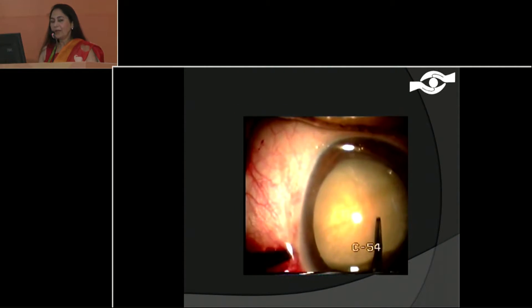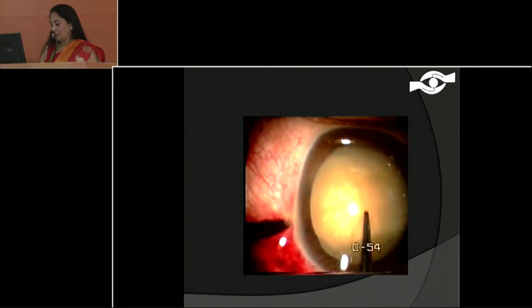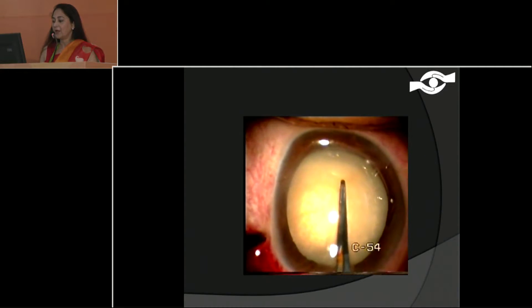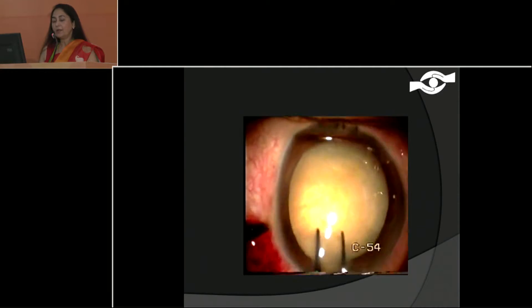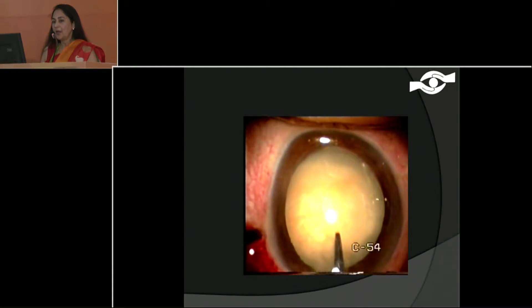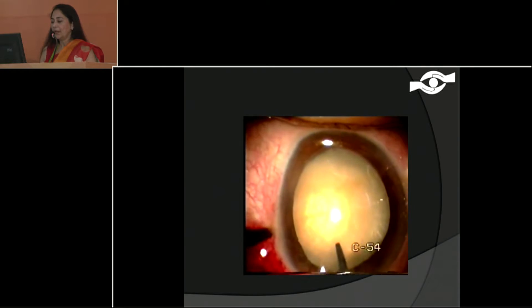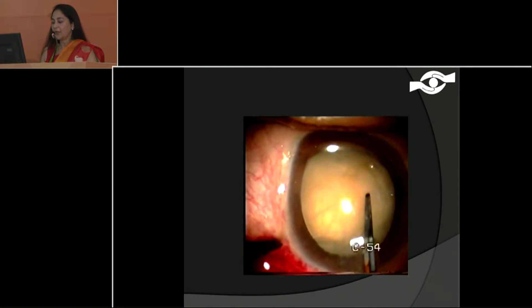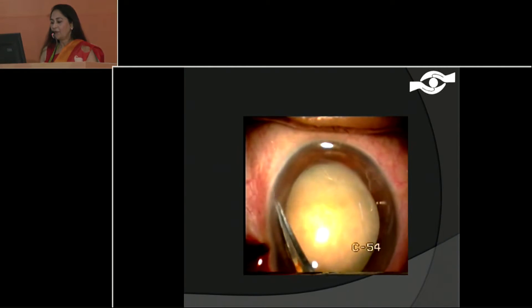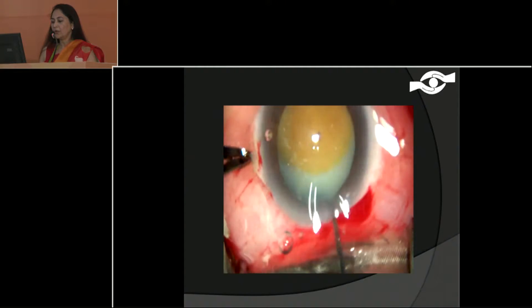This is another case with a different type of lens. It is a mature cataract but there is no liquefied cortical matter coming out. The technique is the same — do not hold the capsule anywhere at the periphery, or try and make a two-stage capsulorexis if you are uncomfortable. All maneuvers have to be in the space of the anterior chamber, never touching any part of the capsulorexis.